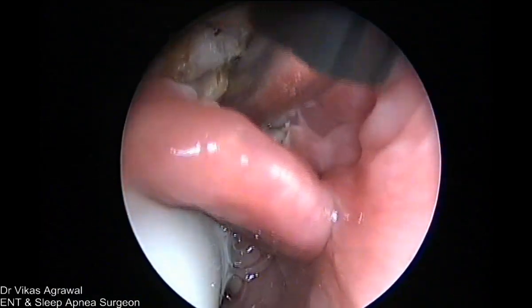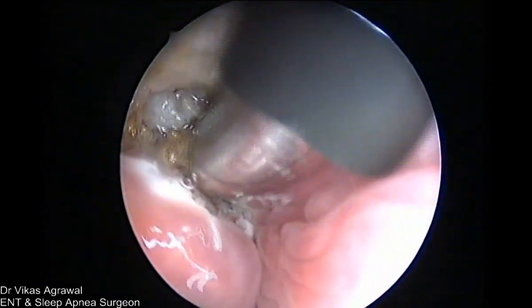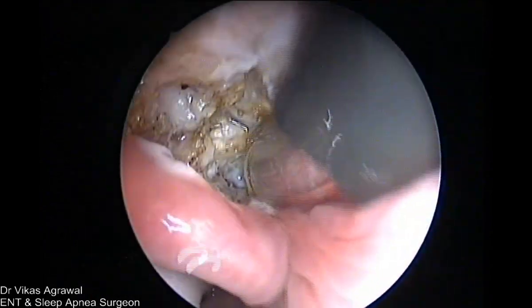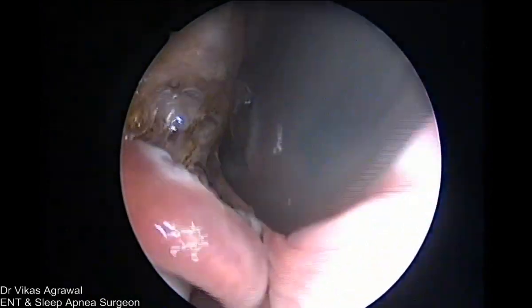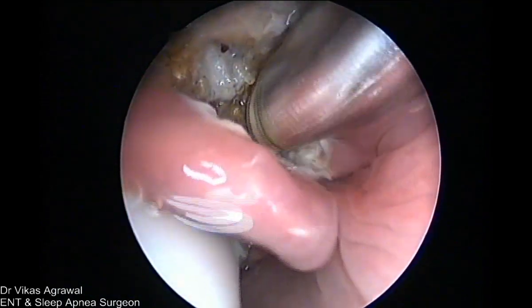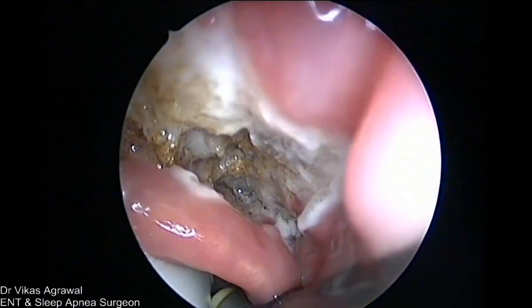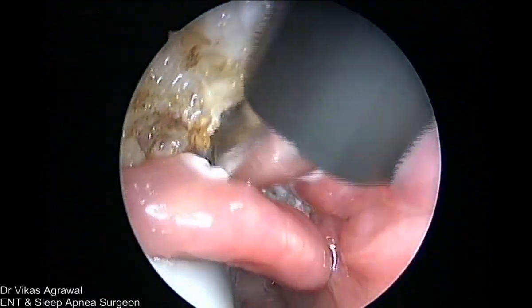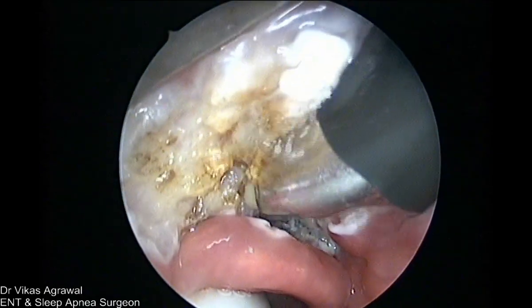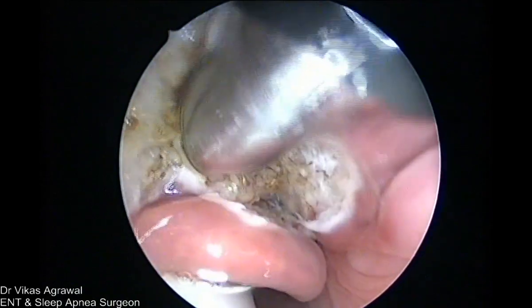I have to go all inside, so at least I have to create a raw area everywhere. After 10-15 minutes, we have to relax the tongue, because ischemic changes will cause edema. Coblation per se does not cause any edema, because it's not a heat driven technology.